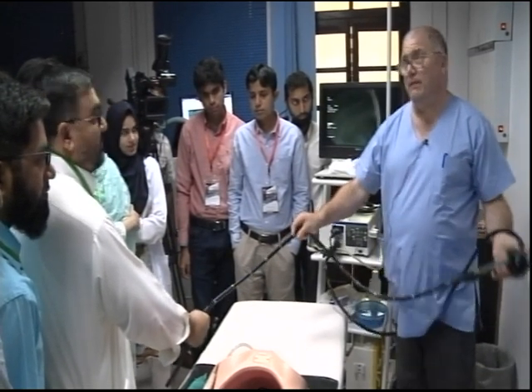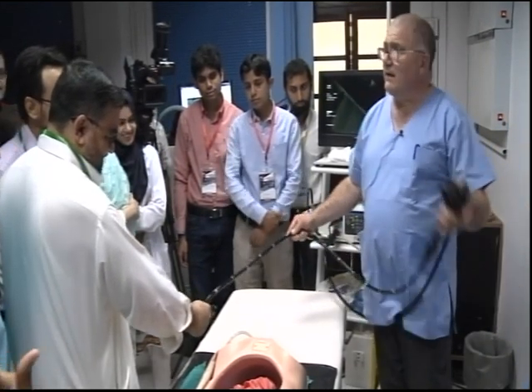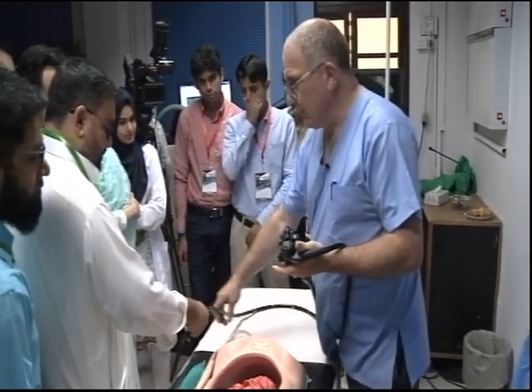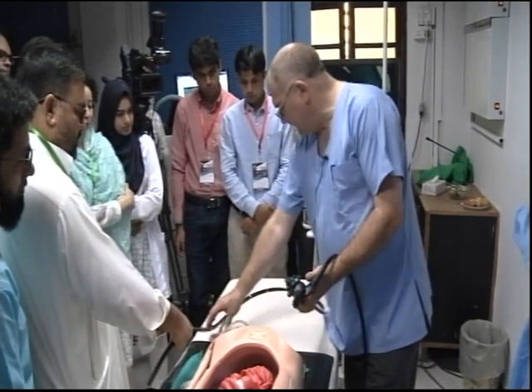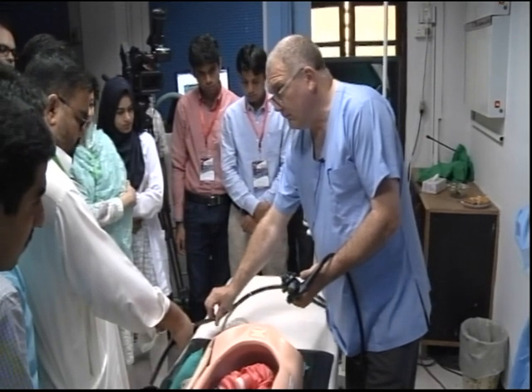I can move it with 50 pounds. Yeah? And that is supported by this. So now relax the hand, just hold it still. So when we torque steering, we want to put a little bit of torque on. Watch the scope here. What's the scope doing as we want to put torque on?